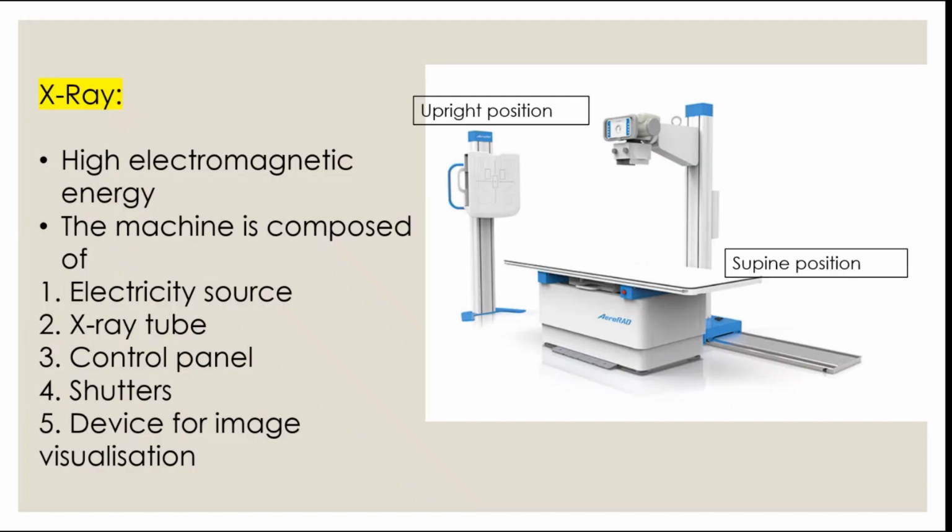Okay, hello everyone. So today the seminar will basically be focusing on the imaging methods. We're going to talk about X-ray, CT, ultrasound, and MRI. We're just going to give some examples and some specifics that we think are important and that you can use as saving questions.